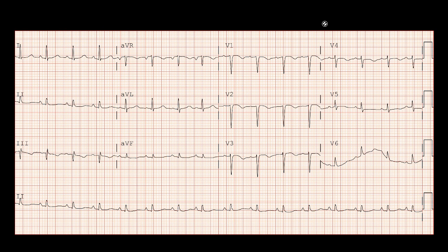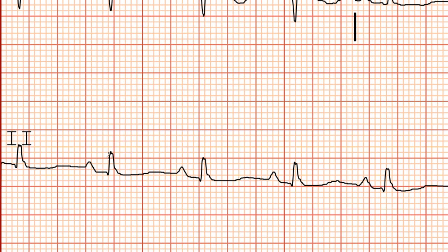So let's try it with this EKG. So we can see here that this rhythm is regular, you can see that the amount of space between each consecutive QRS complex is the same. I'm going to zoom in over here. So we can see over here these QRS complexes are about three boxes away from each other. I just found a QRS complex on the line, and I counted the number of large boxes before I got to the next one, and we can see over here there's about three.